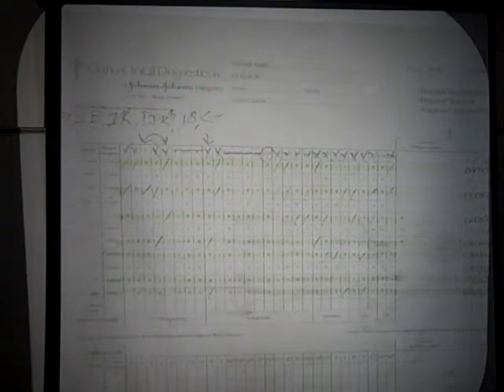And we're looking for an S. Looks like we can use cell line number 3. And we've now ruled out big S, leaving us with an outstanding big E, but narrowing down the field to Duffy A. I can go find one more cell line off of my B panel to rule out big E.